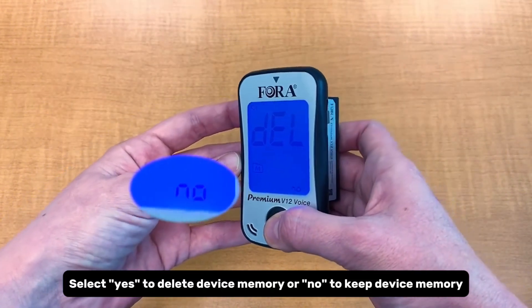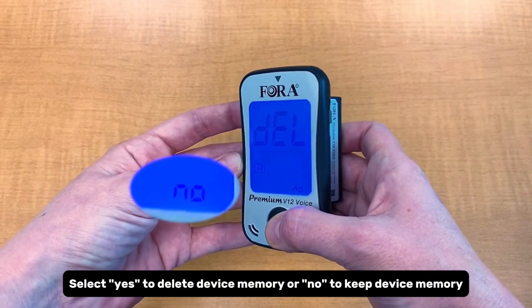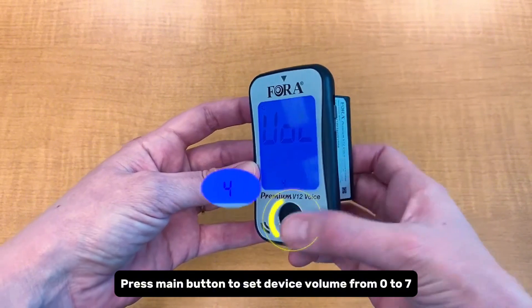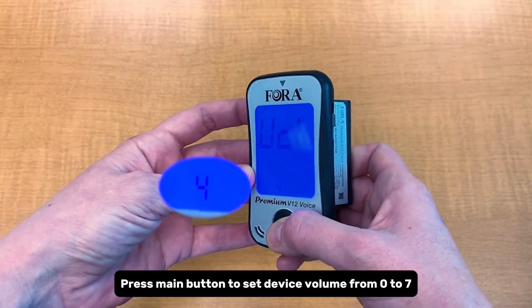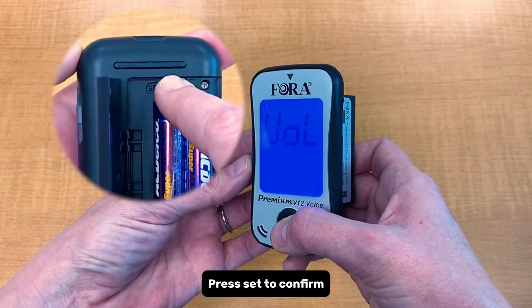Select yes to delete device memory or no to keep device memory, then press set to confirm. Press the main button to set the device volume from 0 to 7, then press set to confirm.